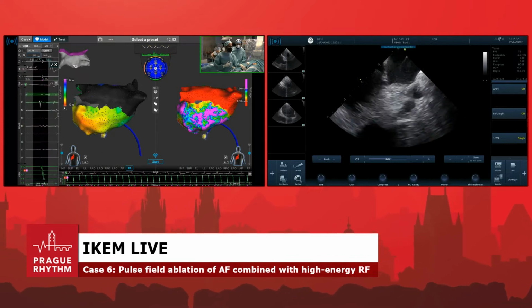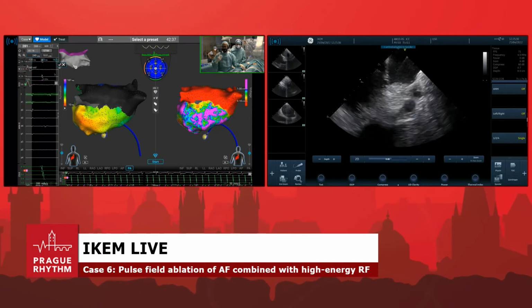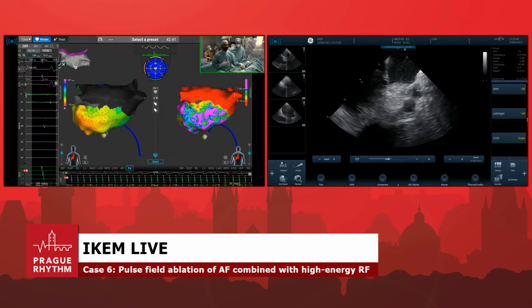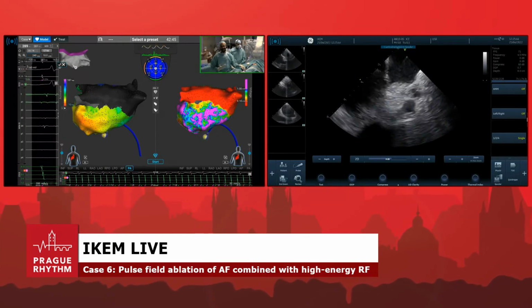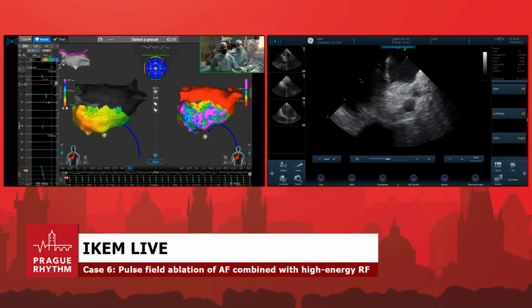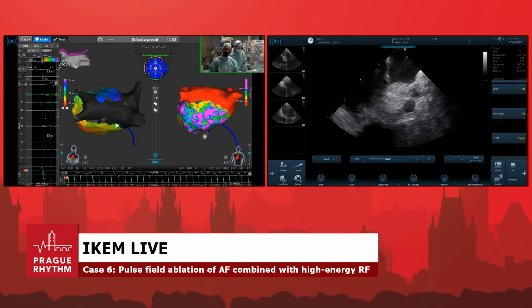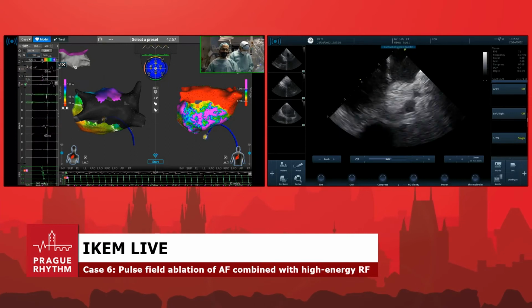Now, it was not associated with delivering energy, so it did not happen just after energy delivery. It could be that, but the territory looks like the RCA because the ST elevations were seen mostly in leads 2 and 3, more in 3 than in 2, which suggests what we typically see with an air embolus or something with a proximal RCA.